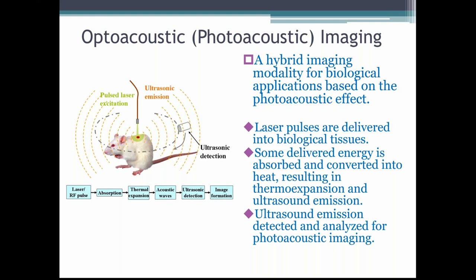As shown in this figure on the left-hand side, the pulses are delivered into biological tissues, and some of this energy will be absorbed and converted into heat, which will result in thermal expansion of tissues and accordingly the generation of ultrasound signals. The generated ultrasound signals can be detected and analyzed for photoacoustic imaging.